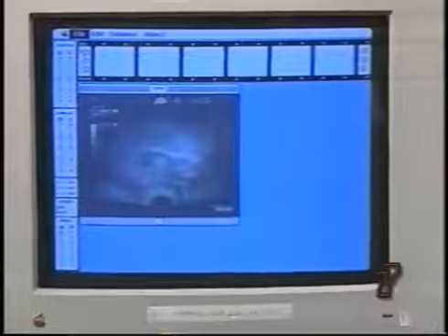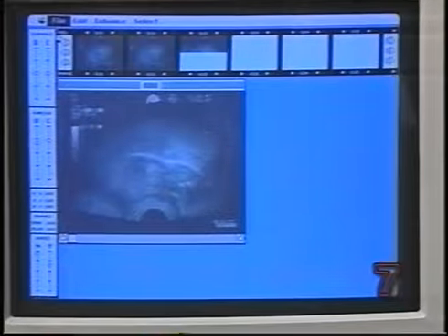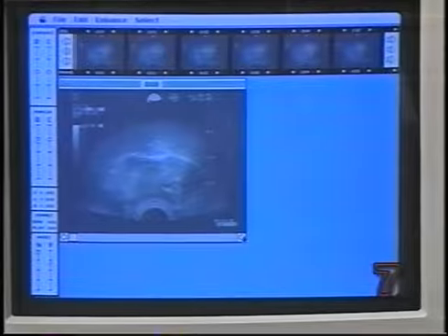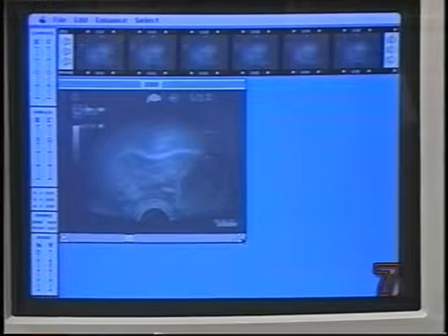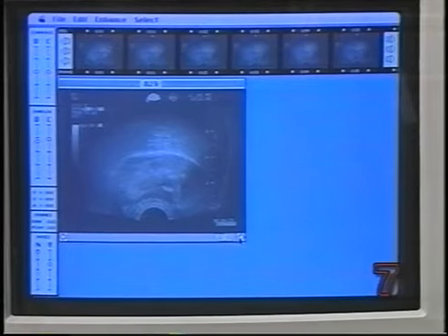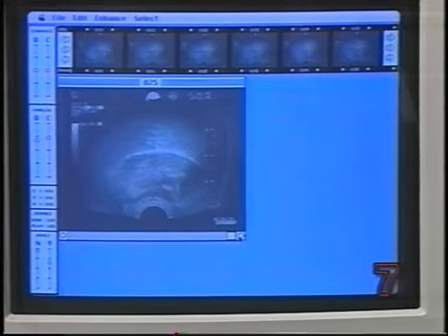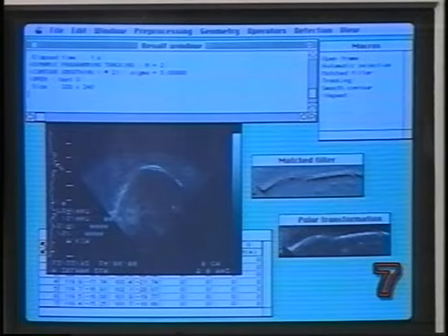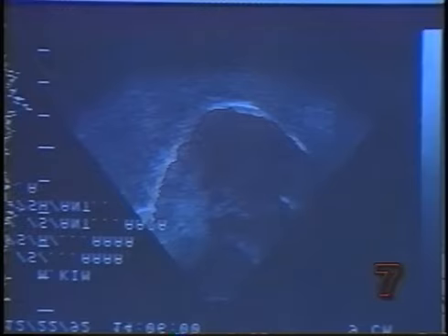In order to collect these frames, I now tell it to begin collecting. And then we can watch it move over time as we scroll frame by frame through the images. In this case, I selected 25 frames, so the first 25 frames it came upon it took. In order to analyze this data, I need to detect the edge of the tongue, or the upper surface of the tongue. And then when I'm all finished, I smooth the contour.